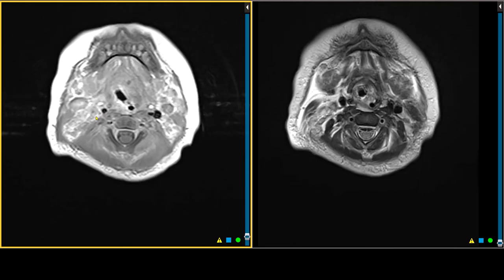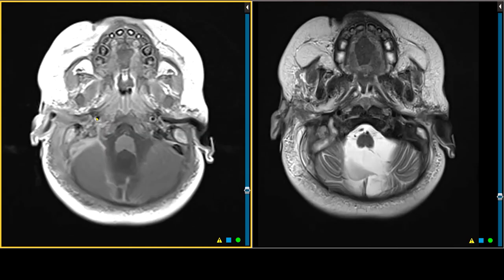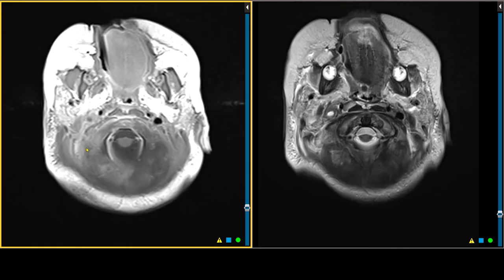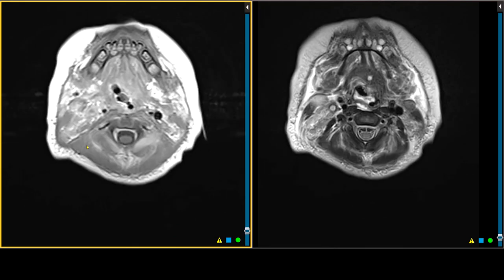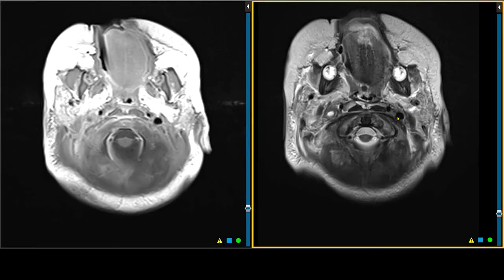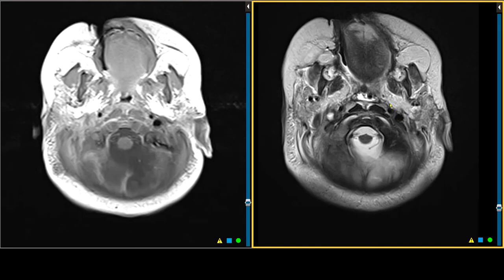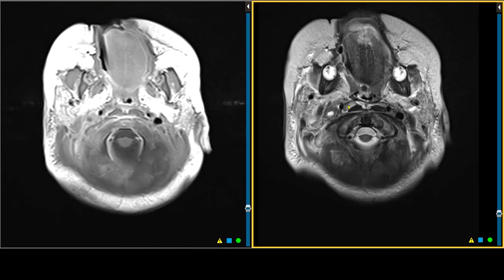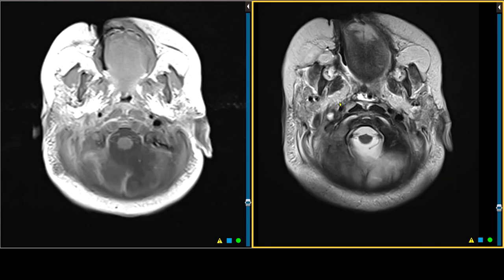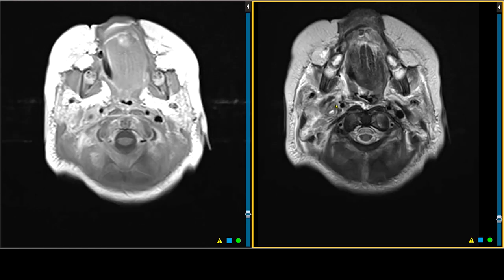So this is thrombophlebitis of the right internal jugular vein, secondary to otomastoiditis. Anatomically, the structures we sometimes refer to in the carotid sheath include the overlying musculature. This darker signal intensity superficial to the carotid artery is the styloid musculature, which defines the post-styloid parapharyngeal space — the carotid space — from the pre-styloid parapharyngeal space, which has fat within it. Part of this tissue here, besides the inflammation, is that same musculature: the styloglossus, the stylopharyngeus, and the stylohyoid muscles.